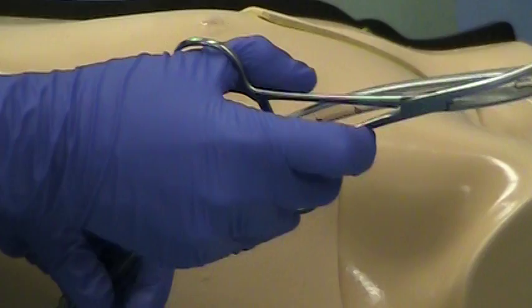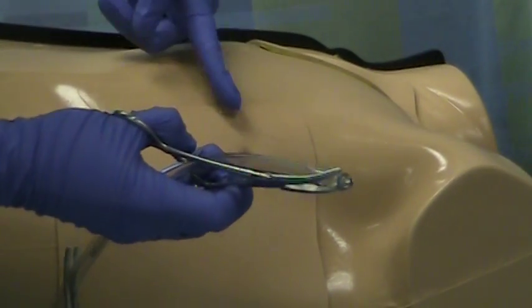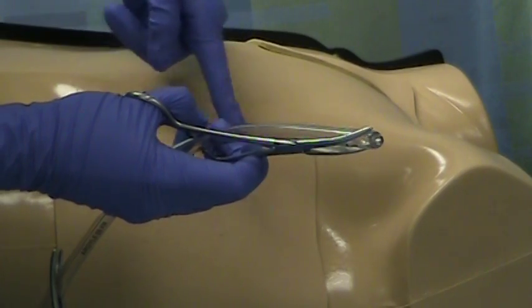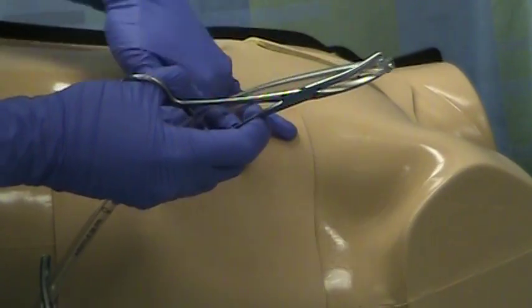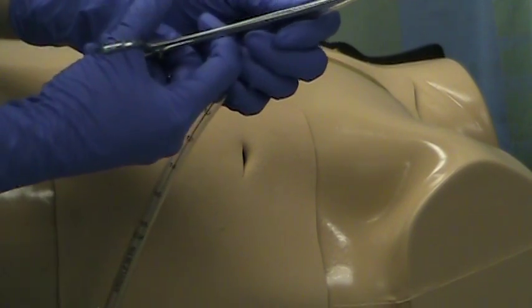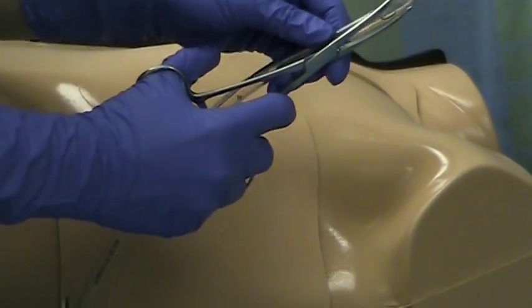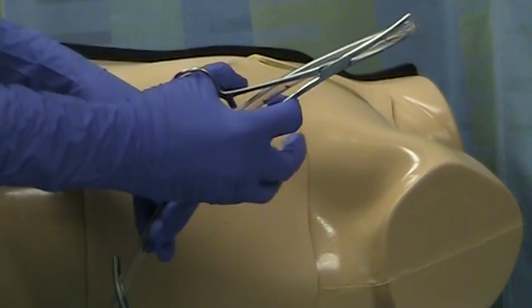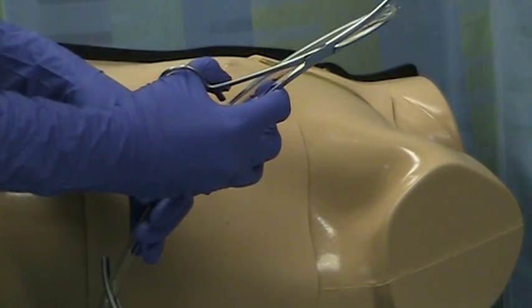Once you've done all that, you need to go ahead and clamp your chest tube up here at the top with your remaining clamp so that you flatten it out so that it actually will insert into the patient. Remember, you have ribs that run parallel like this. You need to flatten this out to get it between the ribs and then open it up. There are various ways to do this. Some people go in through that last hole. Other people just clamp it like this. The most important thing is that you can get it in and not pull it right back out when you try to take your clamp out.